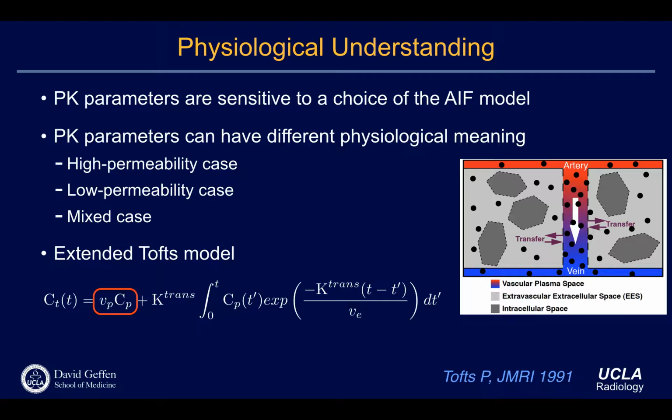So I know I actually covered a lot of different stuff, and sometimes that's why when people talk about DCE-MRI, not many people actually understand what they're talking about. Because there are multiple steps, and this definitely needs strong MR physics, right? This also needs more pharmacokinetic biology related understanding. And this is what you know about what sequence you're using. You have control on TR. You have control on the flip angle, and then based on that you can calculate it. This one you need to know a good T1 mapping method. So again, definitely for the MRI modeling portion, the MR physics is really required.